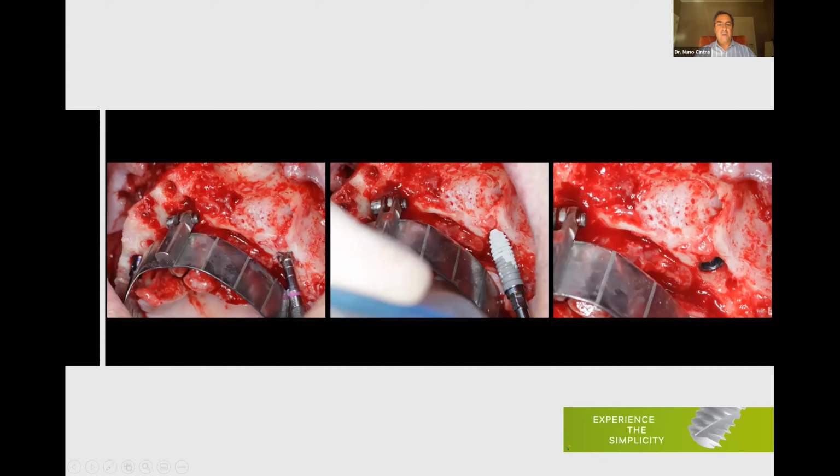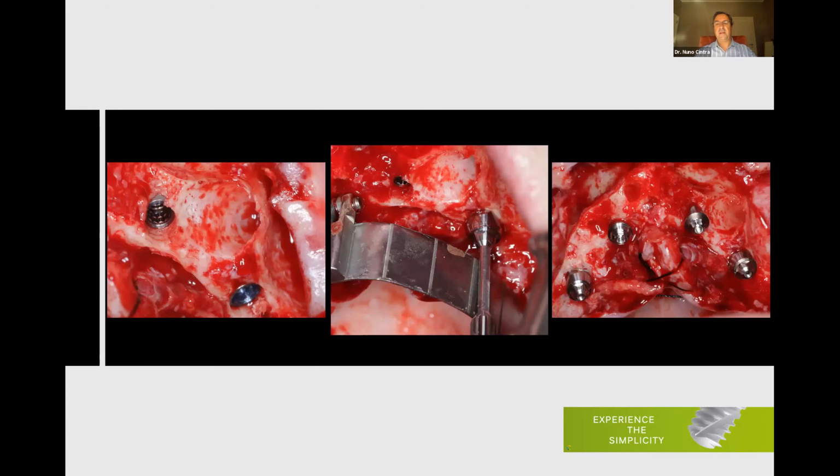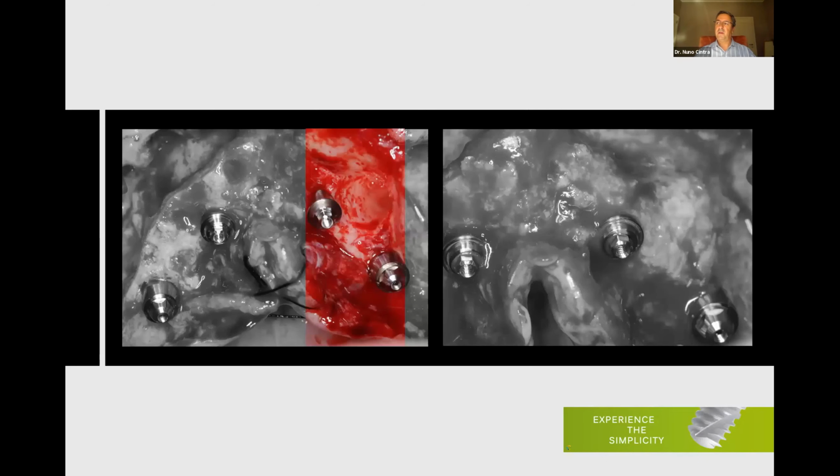Okay, good. And then, as you can see, we were able to place the implant behind the defect. We're very lucky because we had a good thick crest, so we were able to place the implant not through the lesion, not through the cavity of the canine, but behind the lesion. Okay, as you can see here, the implant is behind that bone defect. We compensate the angulation with the 30-degree abutment, as I showed you before. And for that, we use the guide again, remember. And at the end, we can graft and we can regenerate this region with bone, since we have a lot of bone available while doing this kind of approach.